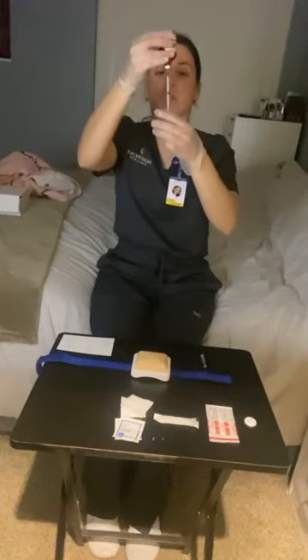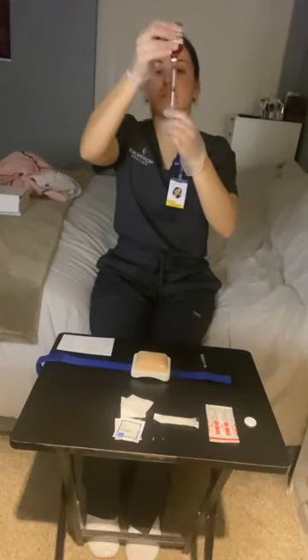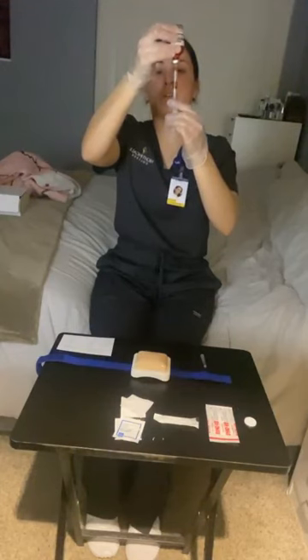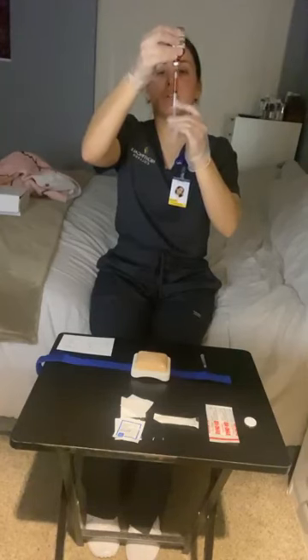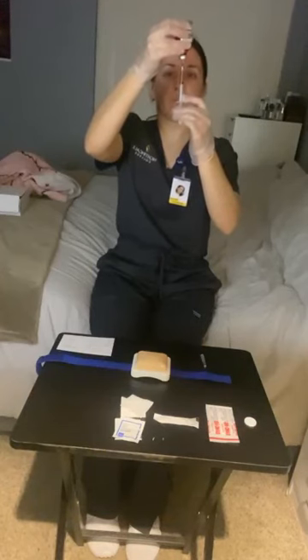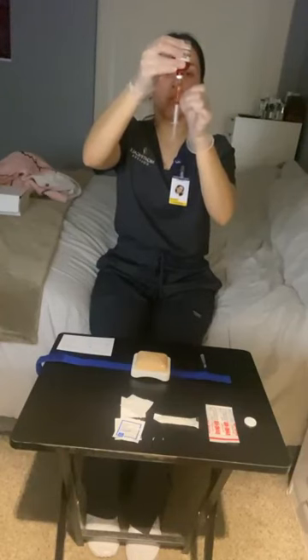I'm going to turn it upside down and get the correct dose into the vial. Okay, and I'm going to tap on the syringe to make sure there's no air bubbles.